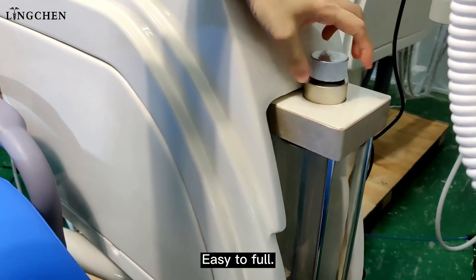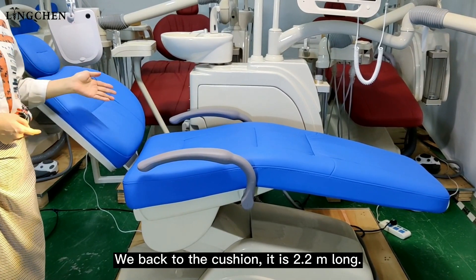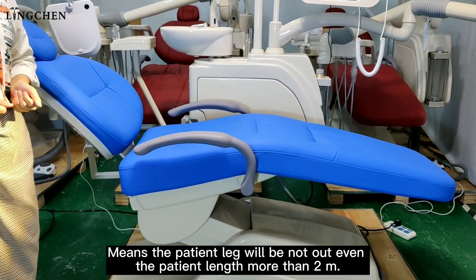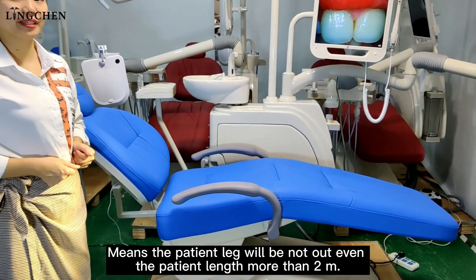The distilled water bottle opens from above and is easy to fill. The foot control is easy to operate and controls all chair movements. The patient's legs will not hang out even if the patient's length is more than two meters.